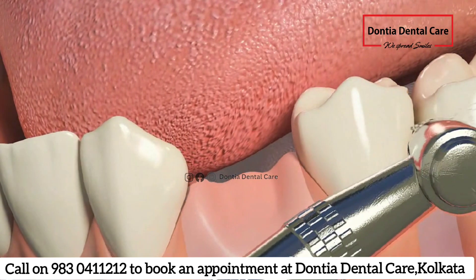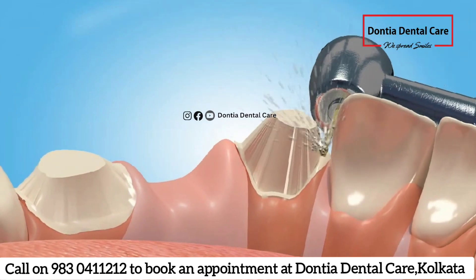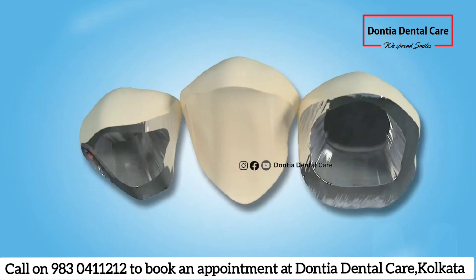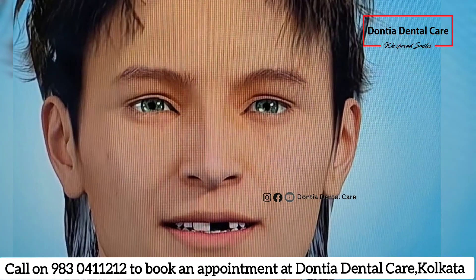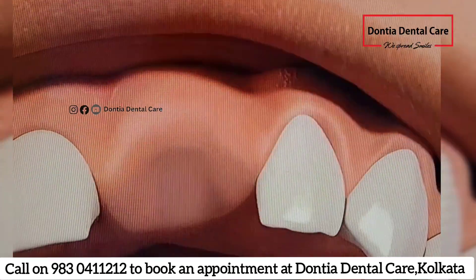As you saw in the previous video on crown and bridge, two teeth need to be shaped so that they can receive the prosthesis of crown and bridge. This is how the missing tooth is replaced with crown and bridge. Keep watching to see how dental implants take support from the bone to hold the crown.